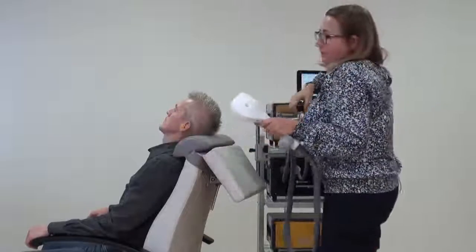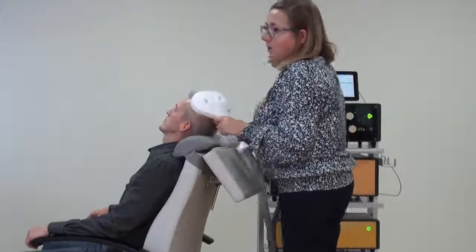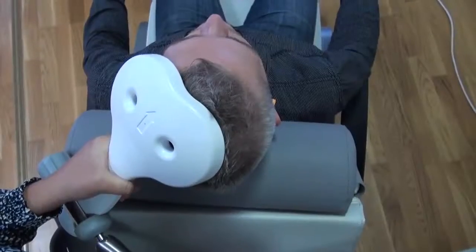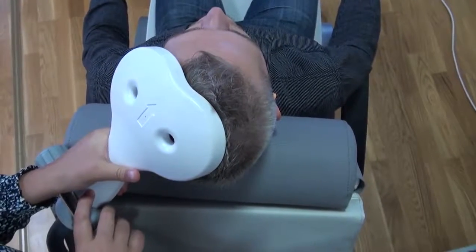Loosen the screw of the flexible arm to move the coil. Place the coil at 45 degrees in the horizontal plane this way. Note the handle is downward and backward.